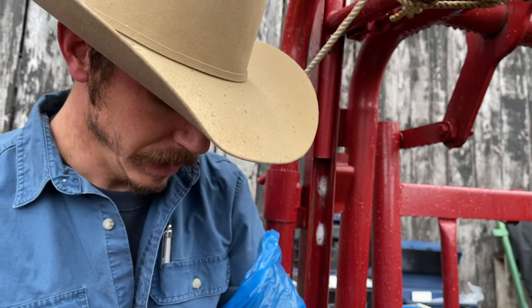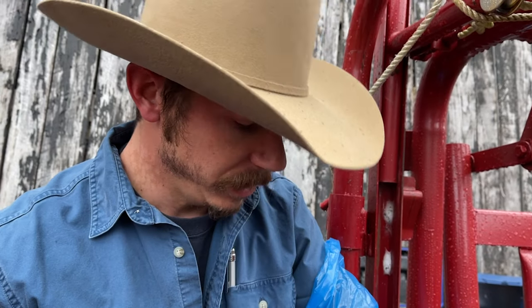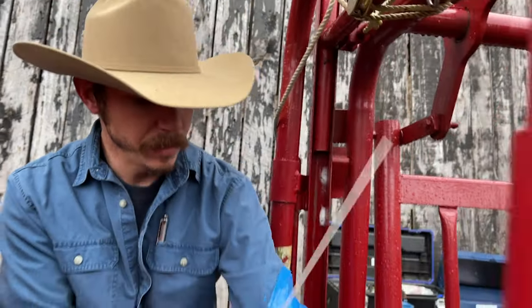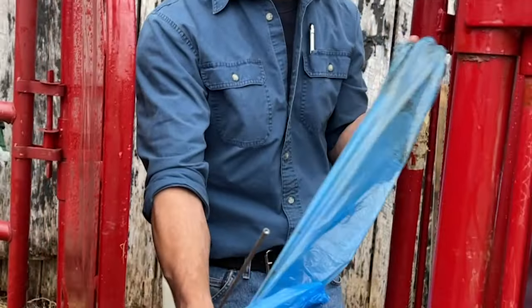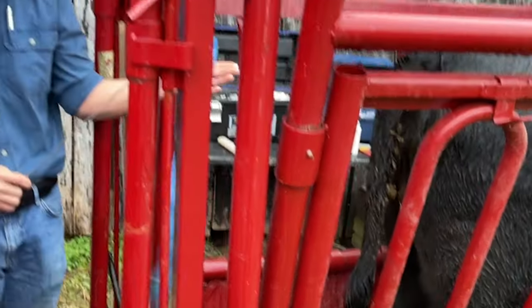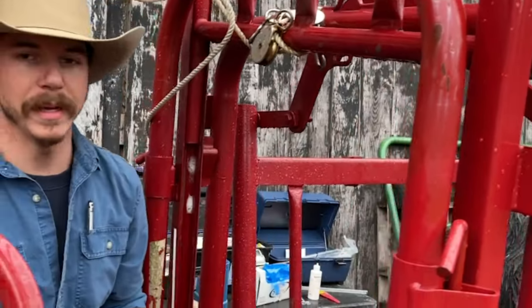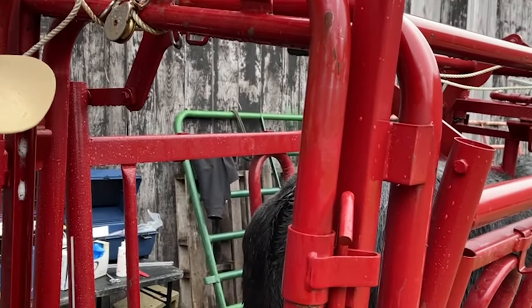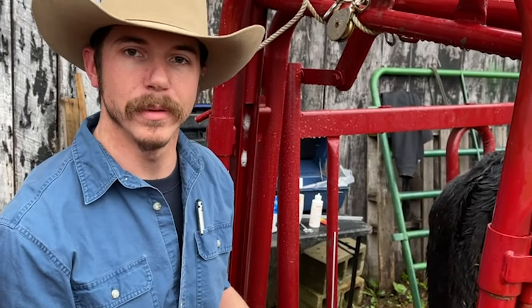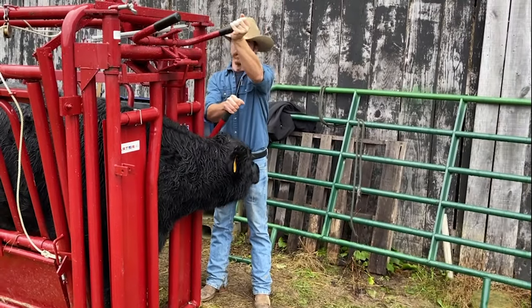She's hopefully bred — we're looking for 283 days from now and hoping to get a little Angus calf. Another tip: when you're done breeding, pull your sheath off and then pull your glove down over the sheath — you've got yourself a trash bag. We bred her. We've got four more here that will hopefully be in heat in the morning, and we'll breed them then.